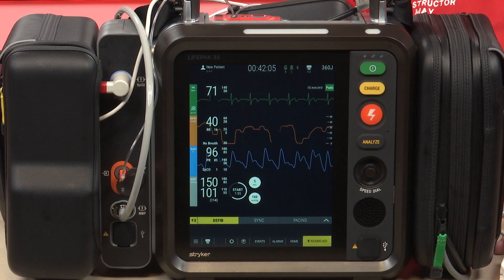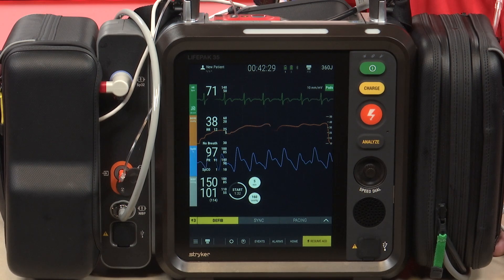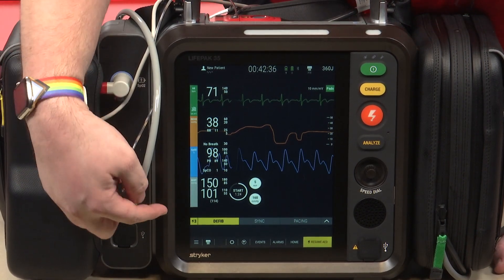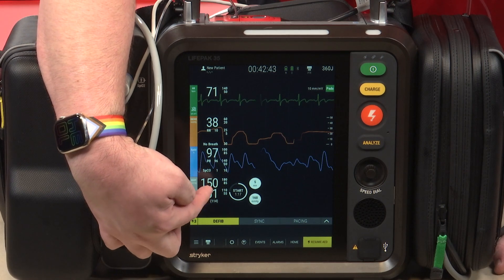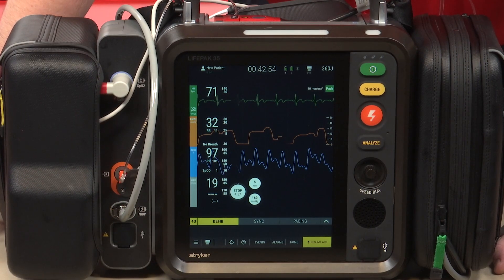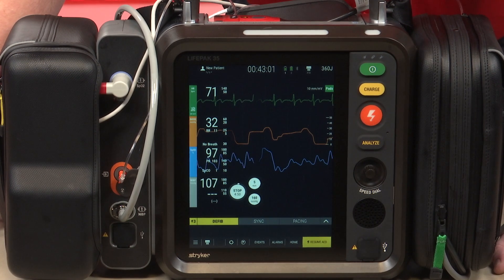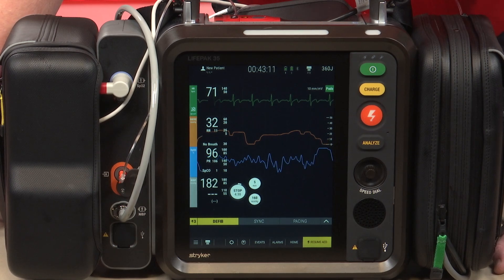We'll start with the blood pressure. On the LifePak 15 you had a manual NIBP button that you would press to get a blood pressure. On the LifePak 35 there's no longer a manual button — instead you have this start button on the screen. It is currently on a five-minute timer, but if you just placed this on the patient and wanted to get a blood pressure, simply press start and it will inflate the cuff. Just make sure you have the appropriate size cuff on the patient, whether it's the adult, child, infant, or extra-large adult BP cuff.